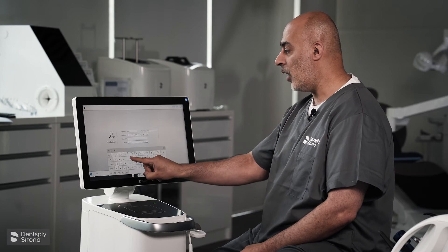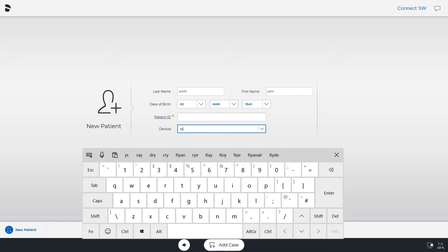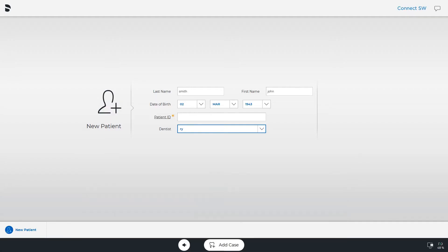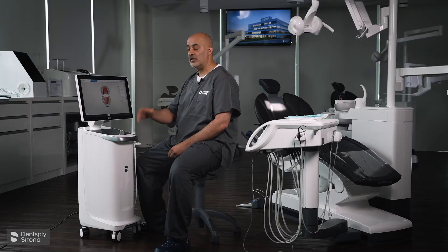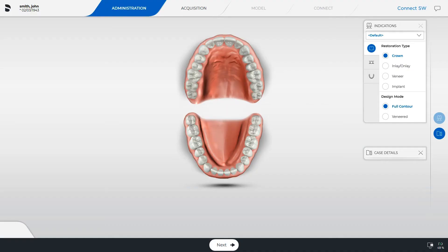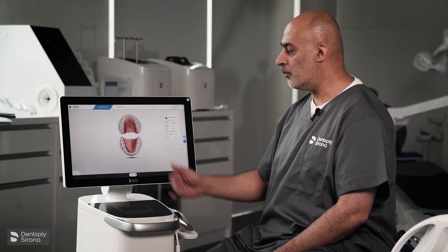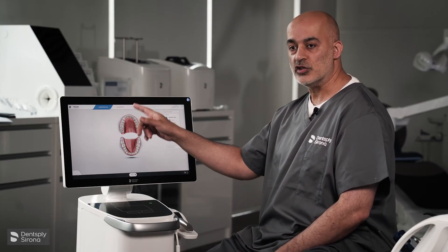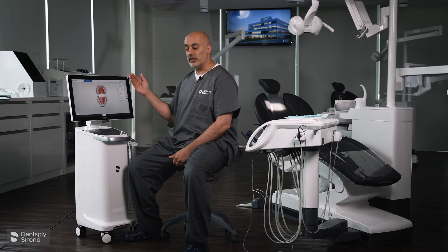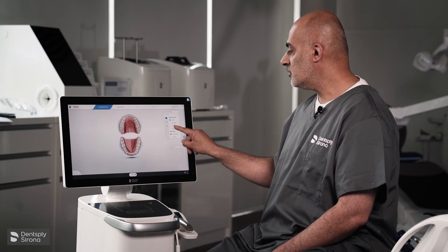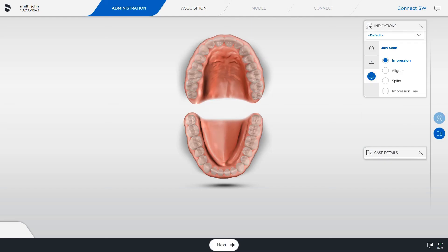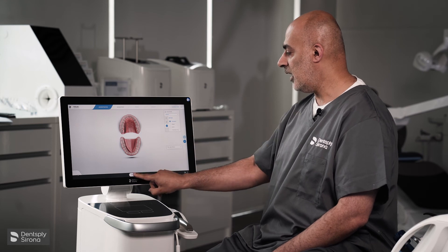I'm going to use 'ry' lowercase, then select 'add case.' We're now ready to scan. Once you've input the patient details, this is the screen you will see — it will have an upper and lower model, which is the administration part of your scanning. You'll then have the indication for why you're taking the scan, with choices on the right. Today we're going to select 'impression' for whitening trays, then press 'next.'